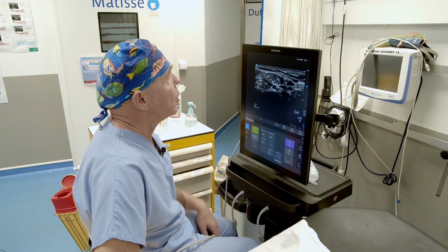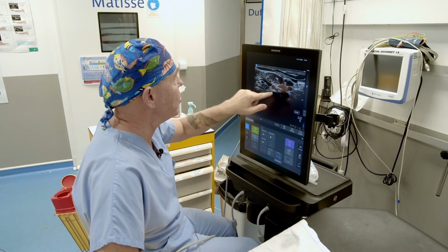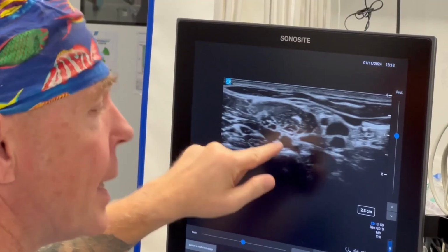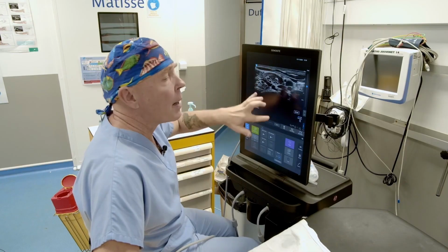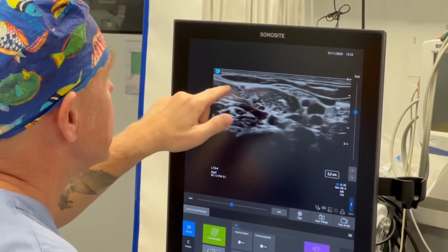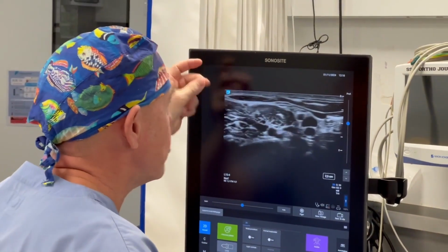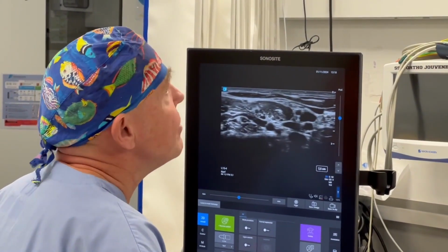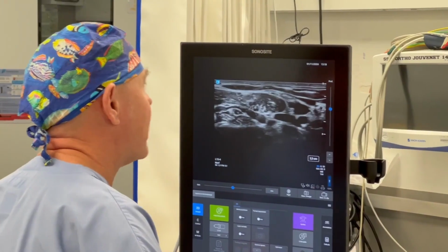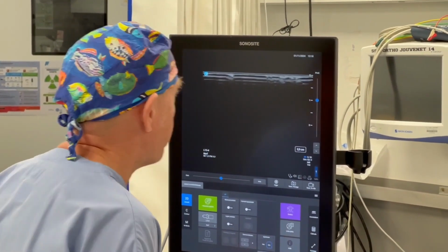But for example, with this trunk level supraclavicular approach, here you can clearly see the anterior scalene, the middle scalene, the superior trunk, the middle trunk, and the inferior trunk. It allows you to perform all surgeries of the upper limb. And if you see that it affects the clavicle a little, you just add 3 cubic centimeters with the same puncture point. And if you feel that you need to cover the inside of the axillary hollow and the intercostobrachial nerves, which is more of a thoracic component, right after that you can do a PEX.